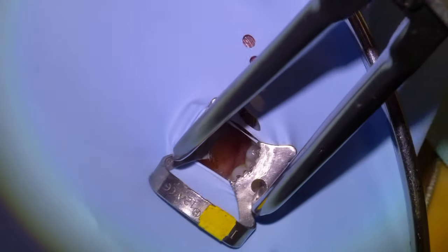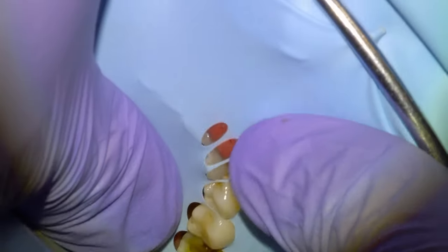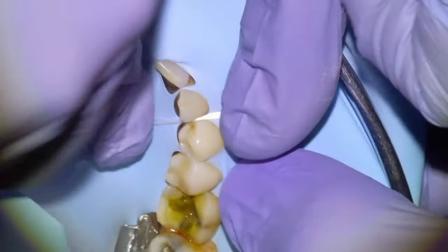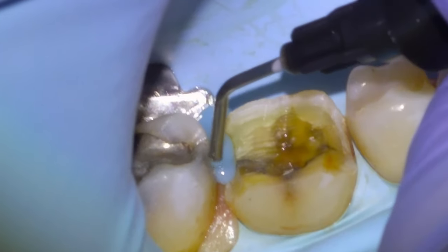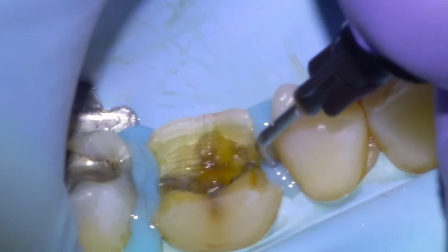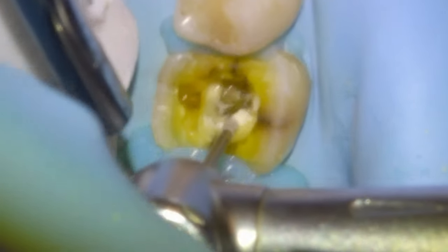This is a case where I told the patient that if I didn't like the look of the pulpal floor we would extract the tooth, but we ended up proceeding with root canal because once we had it opened I was comfortable with the presentation of the tooth. I've done root canal on similar cases and had good results. So we'll do our access prep until we're at the pulpal floor, open it up according to the anatomy, and then go in with a Munce discovery burr. We can see pretty clearly there's going to be four canals just based on the pulpal floor.